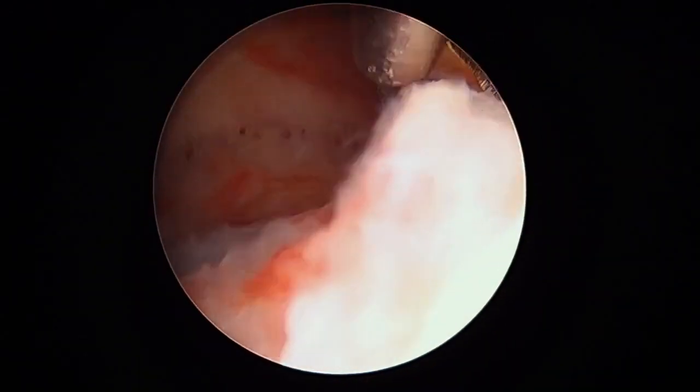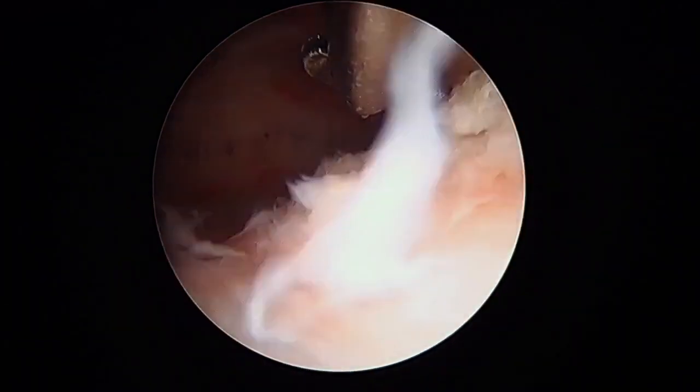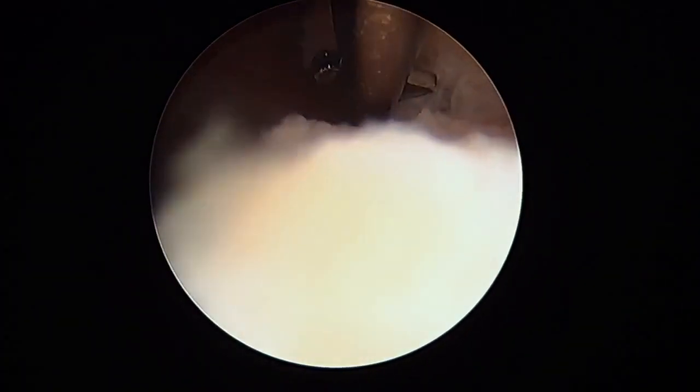Again, if the surgeon is in the correct plane, no bleeding is noted, as scar tissue is completely avascular.